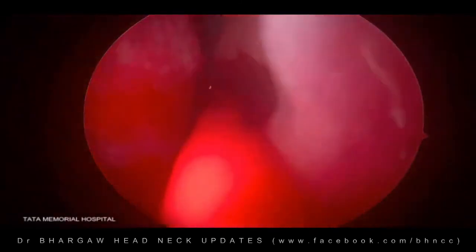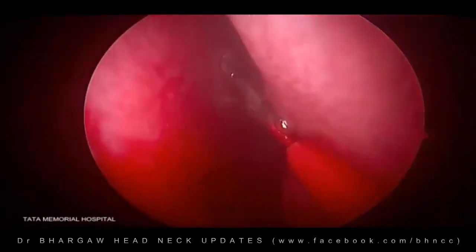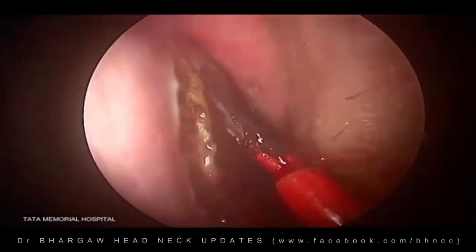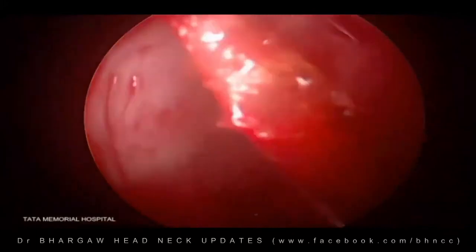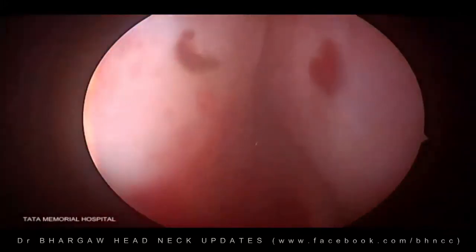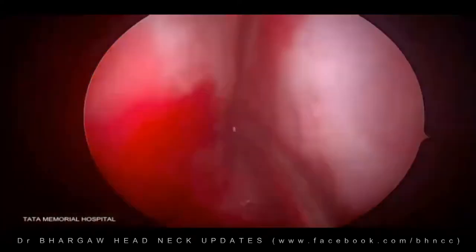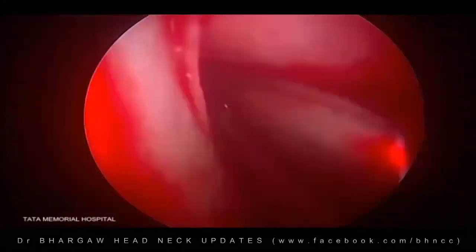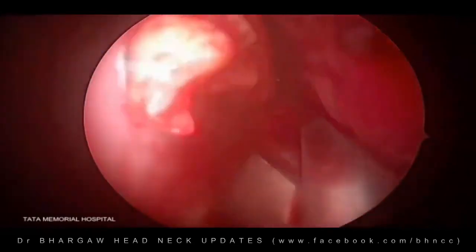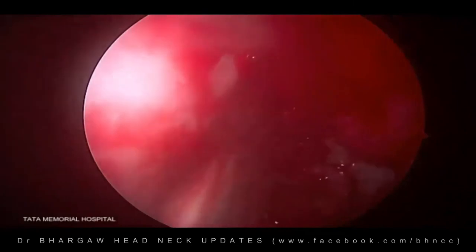We would not have done this if there was disease at the septum or in the roof on this side. We definitely would not have done this Hadad flap. So the Hadad flap has to be decided on a case-to-case basis. It cannot be done in all cases. This is one case where it was possible. Majority of the times you will not be able to use the Hadad flap in a malignancy. Let me stress that fact. Otherwise, for pituitary surgeries, routinely you would do a flap. That's a different thing for benign lesions.